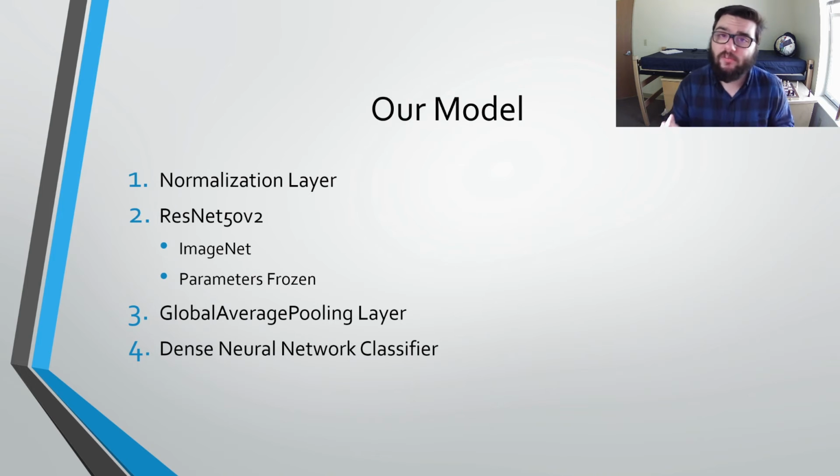And next, and most importantly, we used a pre-built convolutional neural network called ResNet 50 v2. Now, the beautiful thing about using a pre-trained network like this is that training all the convolutional layers and all the kernels inside of them is very difficult and requires a large amount of data, an amount of data that we did not have. However, ResNet 50 v2 was trained on a data set called ImageNet. Now, that consists of 14 million images, all with 30,000 different classifications. Essentially, that means that ResNet 50 v2 is already fantastic at extracting the features that we need.